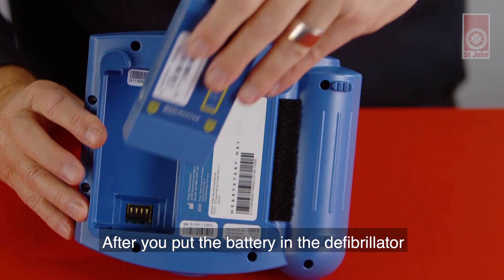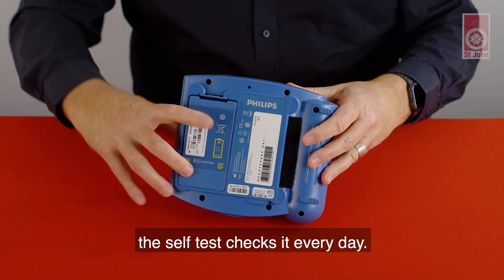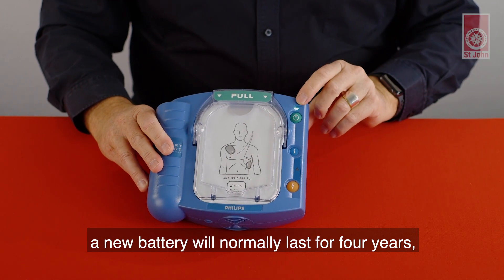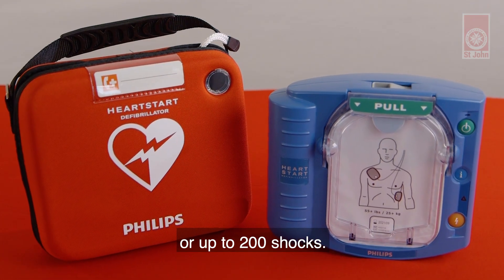After you put the battery in the defibrillator, the self-test checks it every day. When the defibrillator is turned on for use, a new battery will normally last for four years or up to 200 shocks.